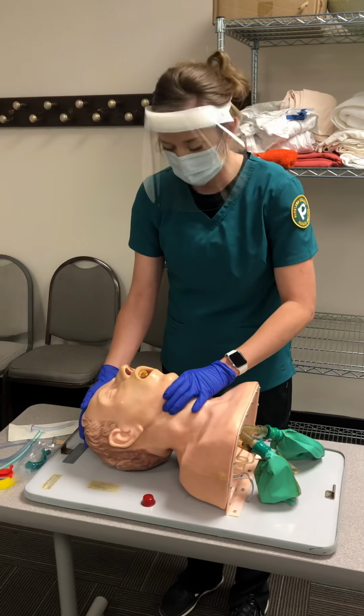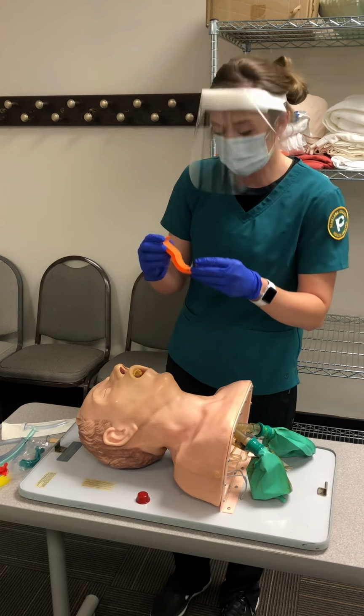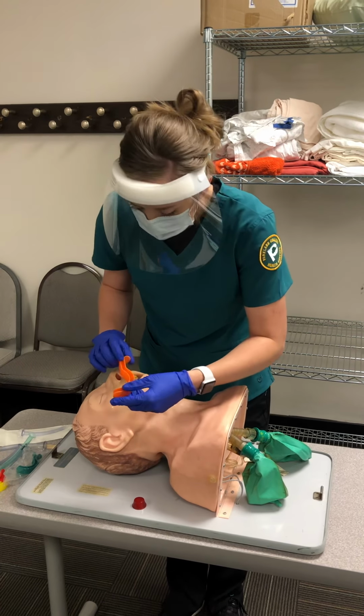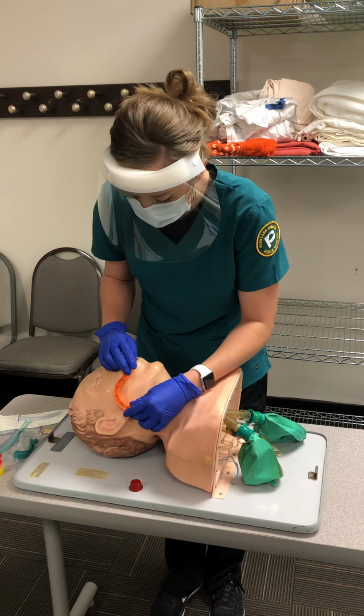I will position the patient by tilting their jaw up. I'm going to measure the airway by placing the top at the corner of the mouth and measuring to the angle of the jaw.